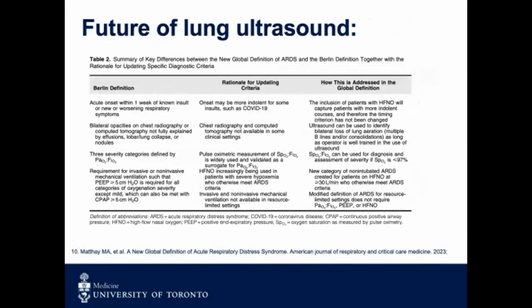And for the purposes of our talk, the big change that's important here is that ultrasound is now an acceptable way to be able to diagnose ARDS. One caveat that you might say is that because B-lines are not so specific, you may be picking up some patients who potentially have cardiac edema, essentially. And so those are the newest guidelines up there.